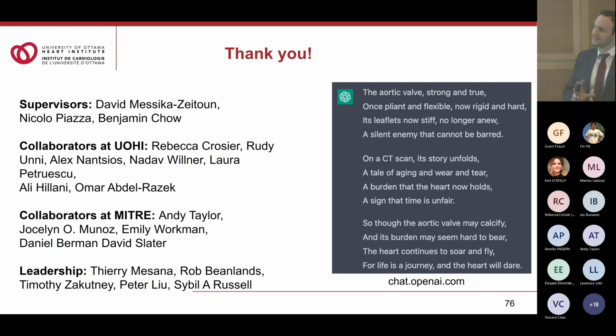So we looked at less severe scans and patients who had more calcification and performed really quite well across the board. So it didn't seem to have a biased performance based on the amount. So luckily in our data set, this seems to be the case. Absolutely, you want to have external validation of the algorithm. So that's a key aspect, and that's exactly what we're adding right now.